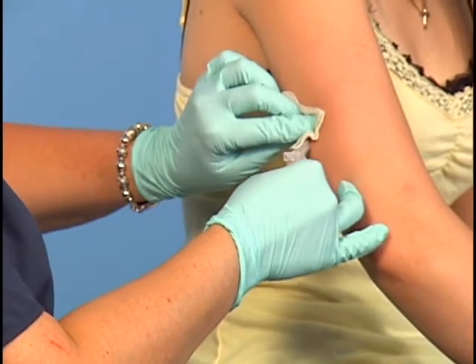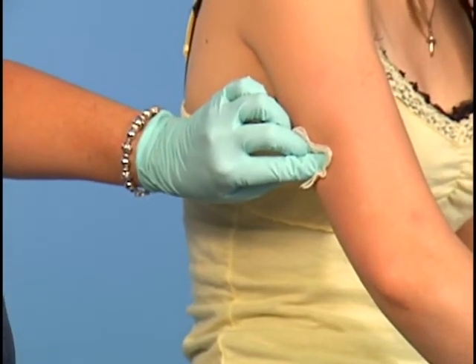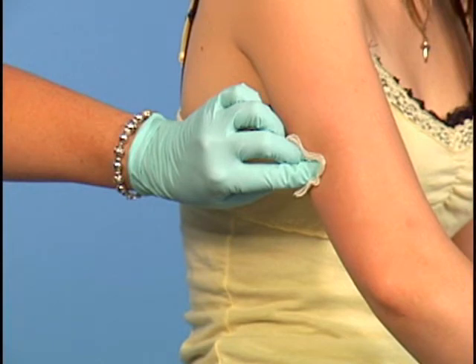Place a gauze pad over the injection site and quickly remove the needle, keeping it at the same angle as was used for insertion. This minimizes patient discomfort. Apply gentle pressure to the injection site with the gauze pad to help distribute the medication so that it is completely absorbed. Avoid vigorous rubbing, which could damage underlying tissue.